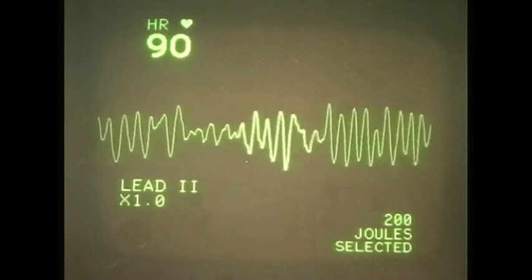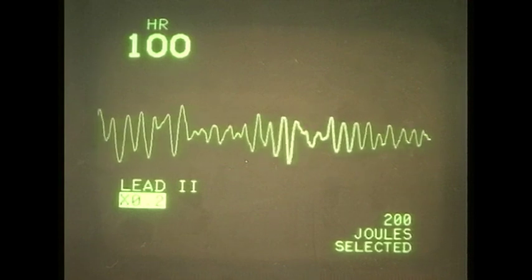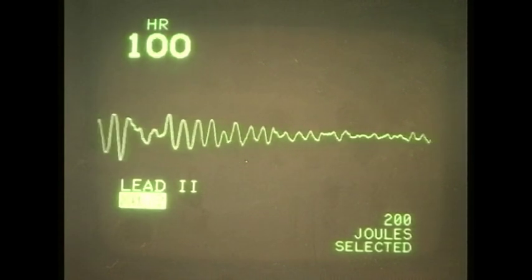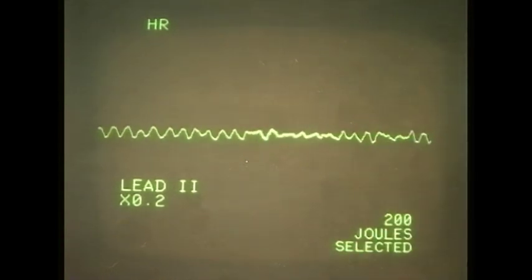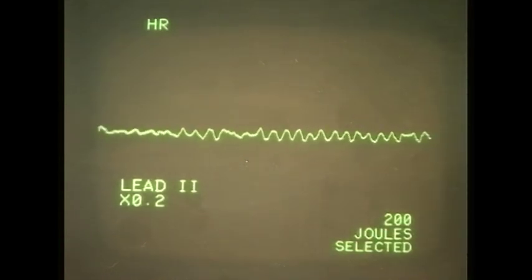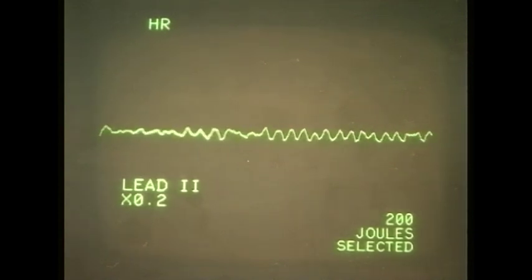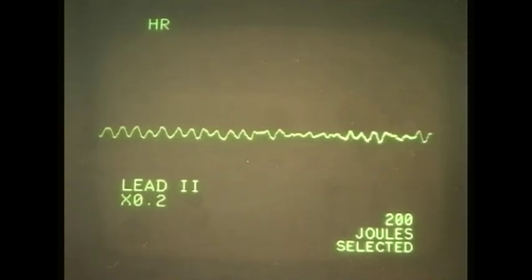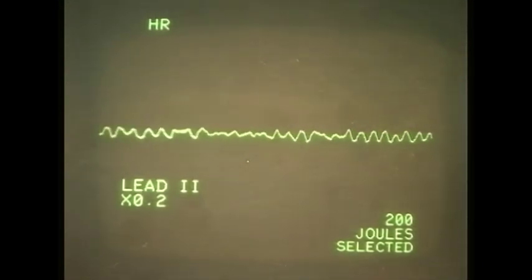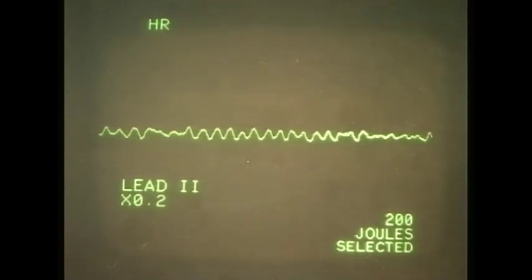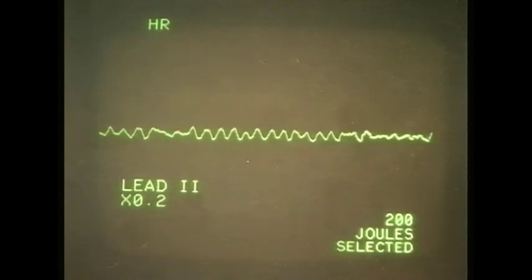As time goes on, what we may see is more of a fine VF. So obviously the amplitude starts to reduce. We still see the chaotic pattern, but the amplitude is much less. And this would need to be treated by defibrillation? By prompt defibrillation. Providing the patient was unconscious and pulseless? With ventricular fibrillation, most patients will be unconscious very quickly.